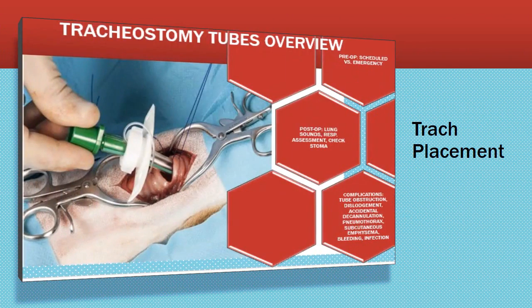So how do these patients get these trachs? The patients are going to have a trach either as a scheduled procedure, but most likely it's going to be put in as an emergent procedure. So it's going to be an emergency that calls for them to end up with a tracheostomy. In this picture, this is a procedure of putting in a tracheostomy. A tracheotomy, which is a surgical incision, can be an emergency procedure.